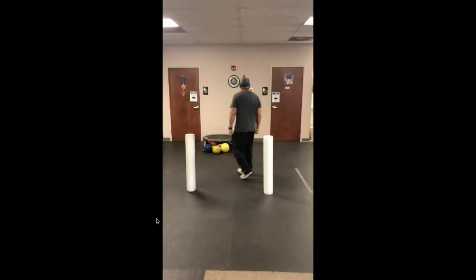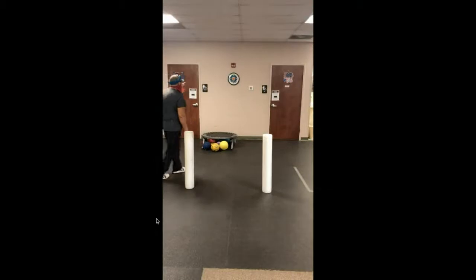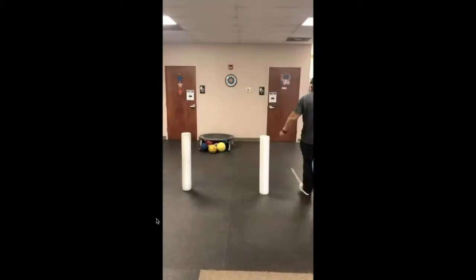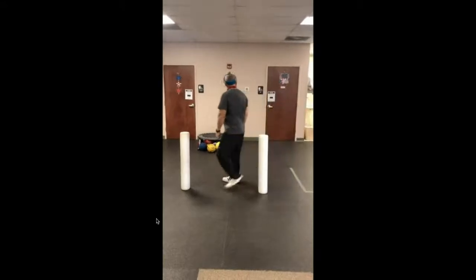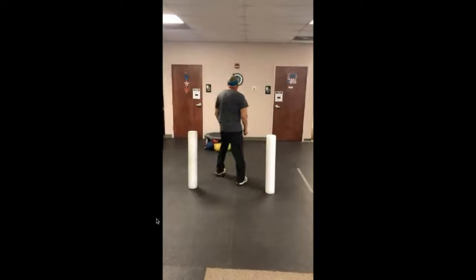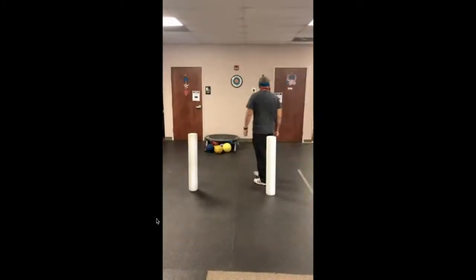The laser helps us understand if he is maintaining there. You can see right there, he had to look down at the ground to see where he was going to walk, and the laser automatically follows right there. So going behind that right-sided target really is tough for this particular individual. He wants to look down. You can see that again. He just doesn't feel comfortable over there.